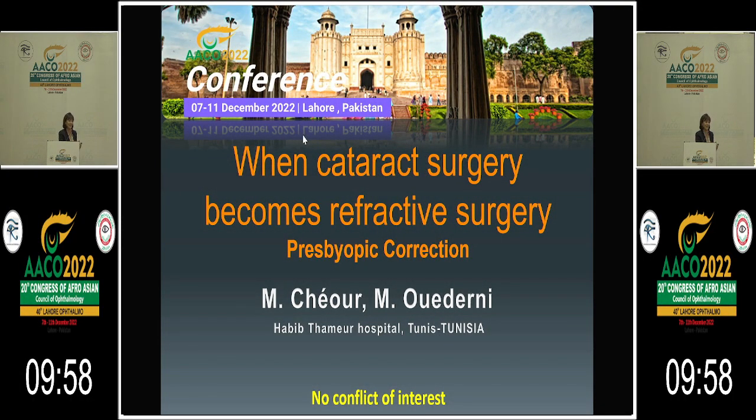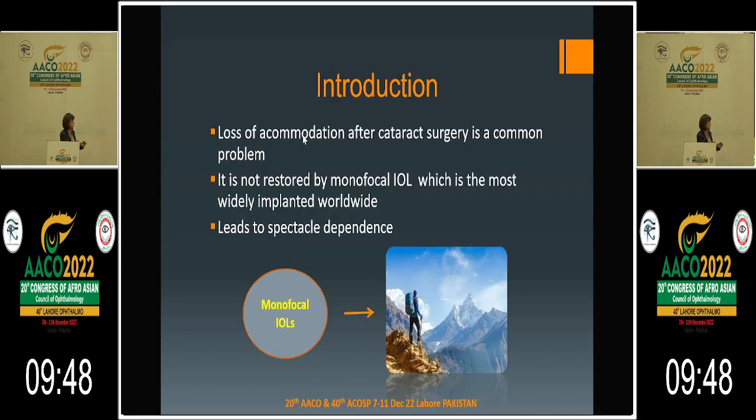I'm going to talk about the correction of presbyopia after cataract surgery. I have no interest to declare. As you know, loss of accommodation after cataract surgery is a common problem. It's not restored by monofocal IOL, which is the most widely implanted worldwide. Also, loss of accommodation leads to spectacle dependence.